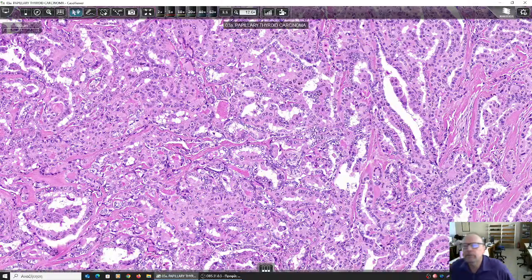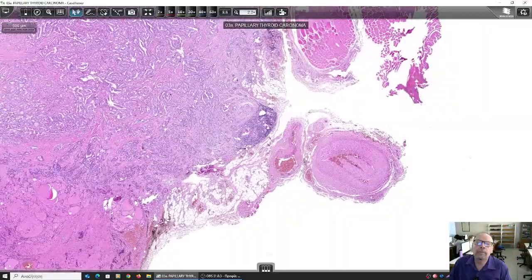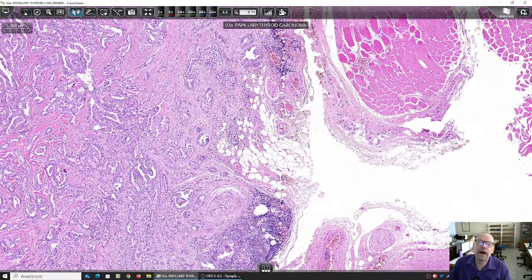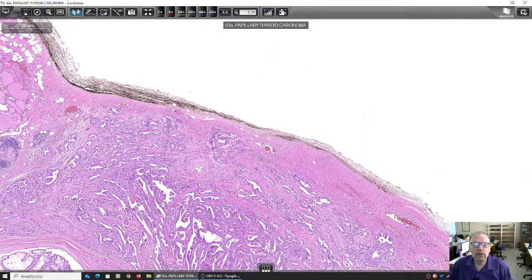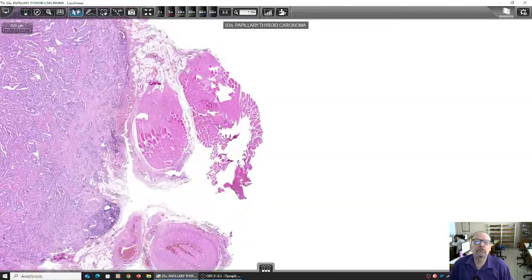Okay. That was the papillary carcinoma, and we would always check. Ah, look here. Oh no, what happened here? We see some parts of the papillary carcinoma invading beyond the capsule of the thyroid. So this is extracapsular invasion, and it is important to be reported. And we should also check the margin, either of the thyroid capsule or the surgical margin of soft tissues.